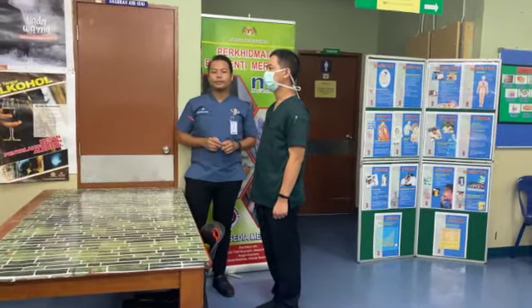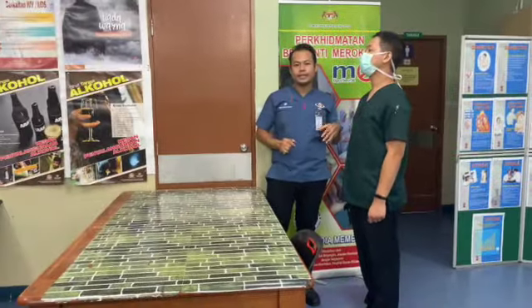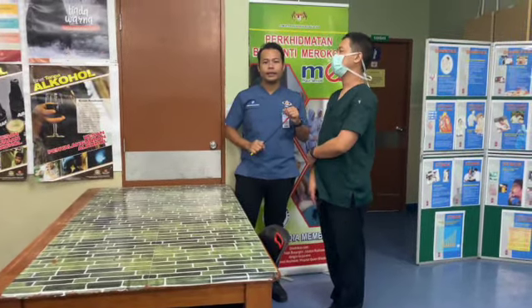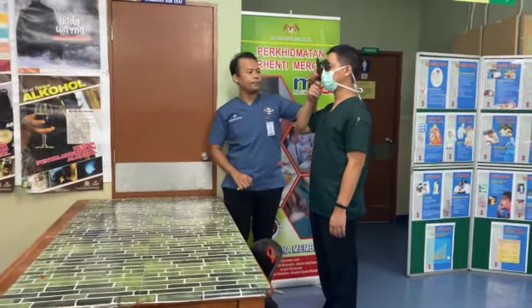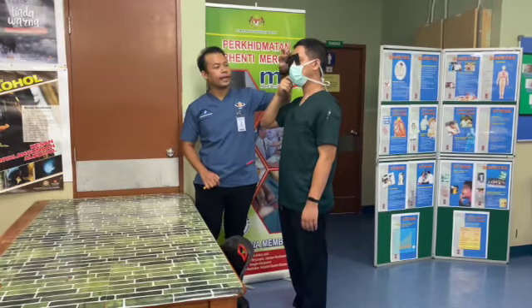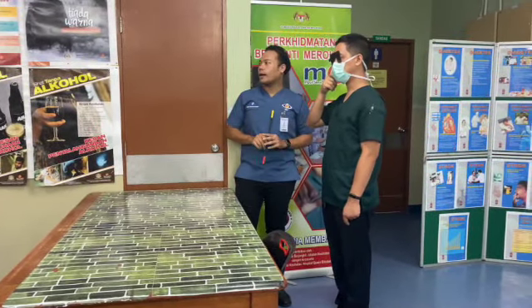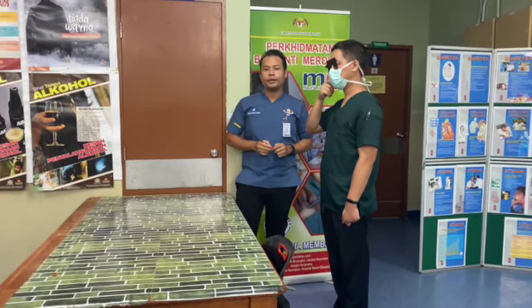If the patient is unable to read from 6 meters from the top to the bottom, we need to adjust the distance from 6 to 3 meters, and then use the pinhole. So we can start again from 3 meters and then close the pinhole. Then ask the patient to read from the top to the bottom, and the result should be written based on the number of lines the patient is able to read.